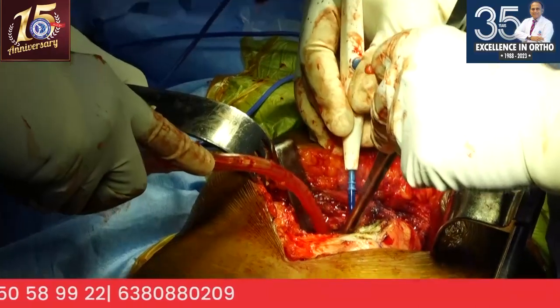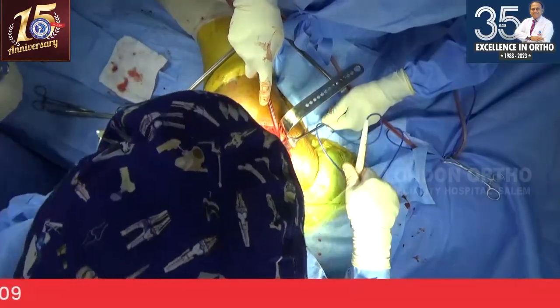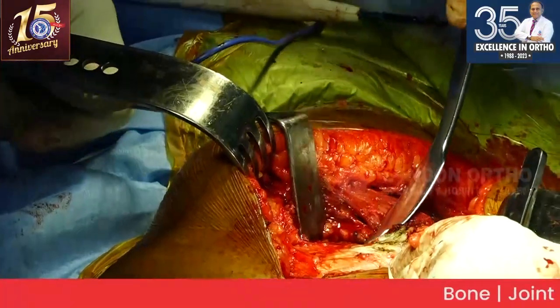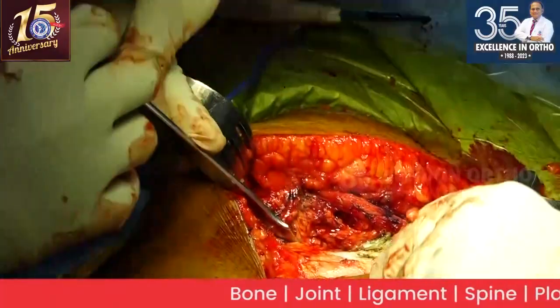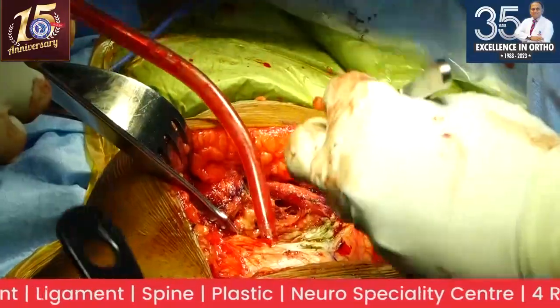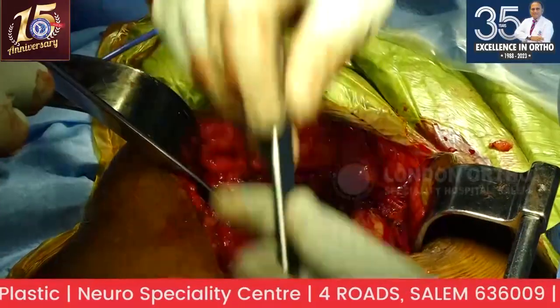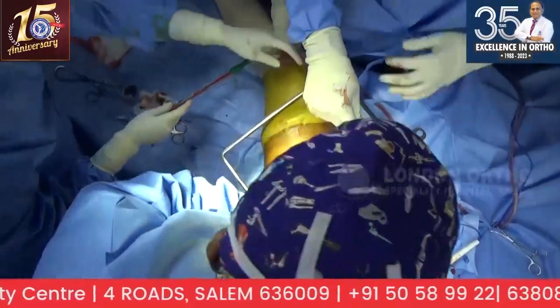So I go along the neck, up to the acetabulum, then take a Homans. One, put it along the inferior neck. No tissues removed, they are all only separated. This is the second Homans on the superior part of the neck.